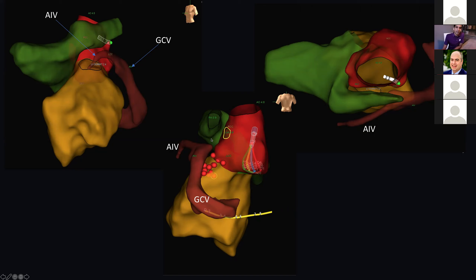I did take activation times in the RVOT, but look how high they are compared to where I would have liked to ablate. The pulmonary artery times were very late compared to the AIV-GCV times, and the epicardial times were also later compared to the endocardial times and the left coronary cusp times. So this is where we ended up ablating — not necessarily the site of origin, but the closest spot you can get to in order to eliminate this LV summit VT.